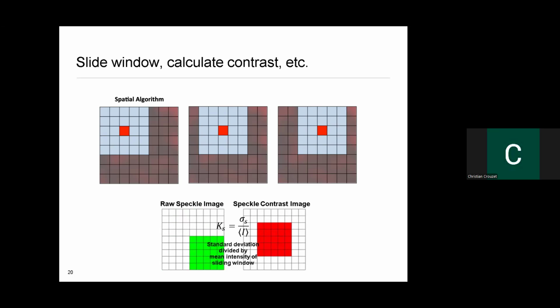Yeah, so there are different ways that you can account for that depending on your sliding window algorithm. Sometimes they fold the image over, but in general, we have so many pixels in our image. We're like 1000 by 1000 that removing like a 2 pixel area around the border really isn't going to do a lot to our images. But there are ways and algorithms to kind of account for those edge effects depending on what you're doing.